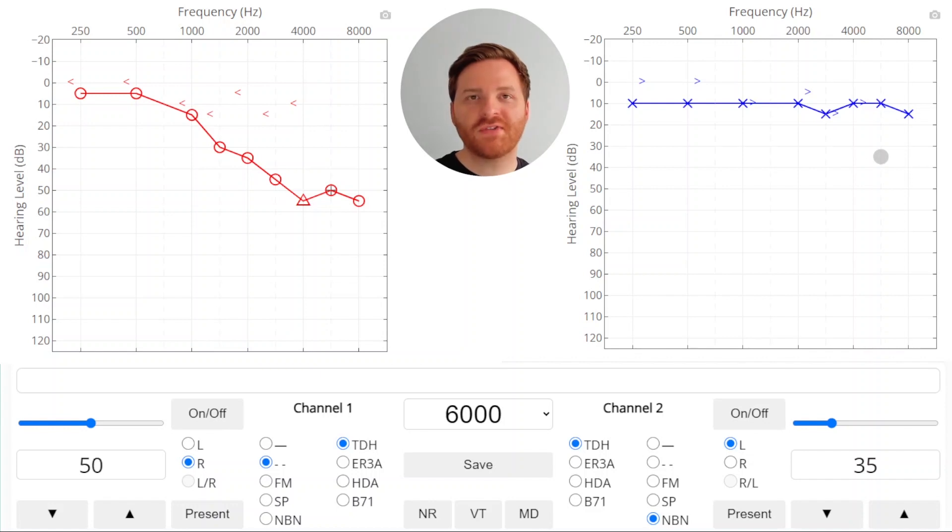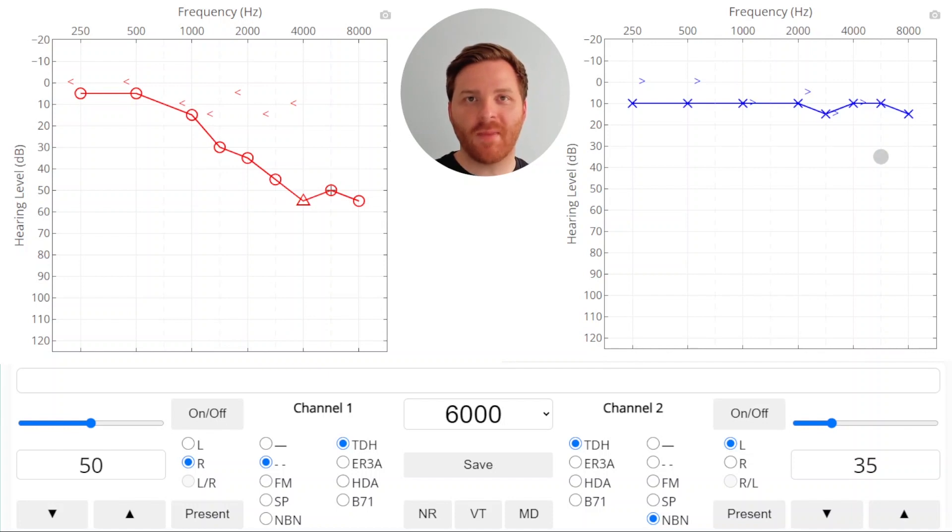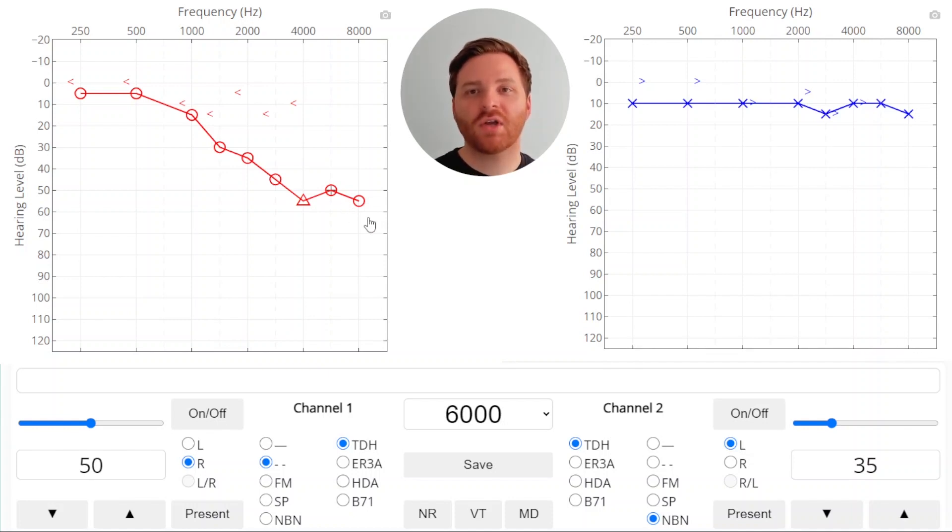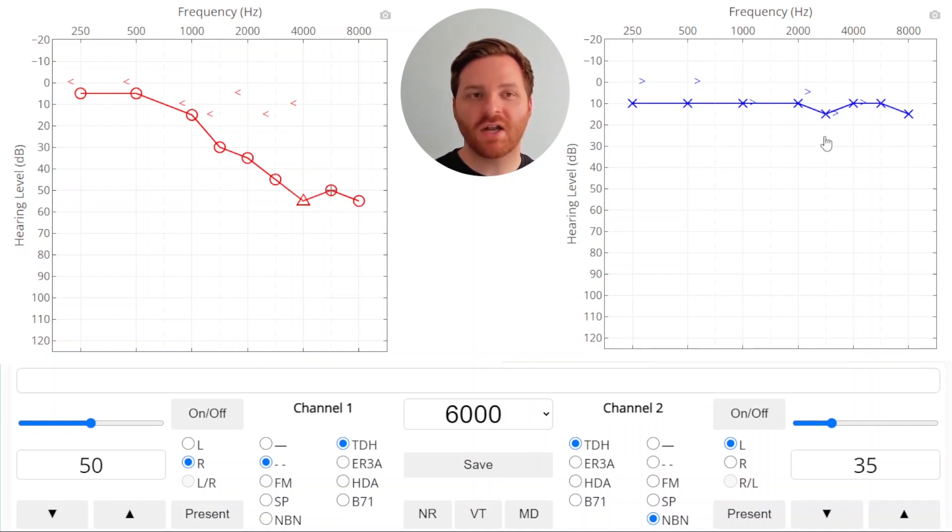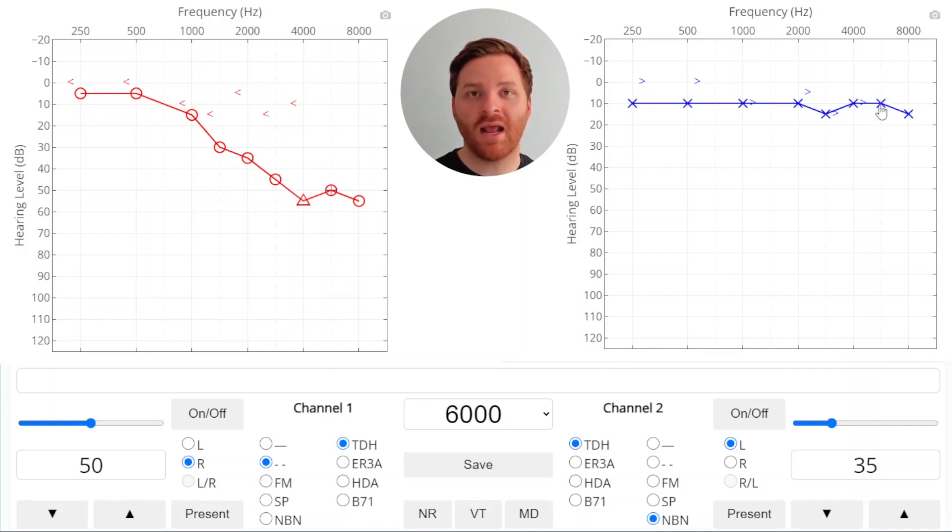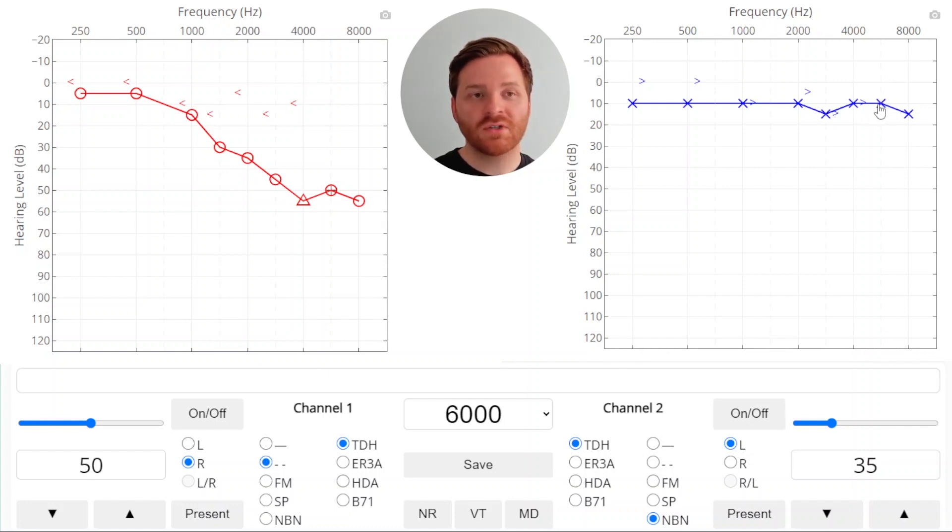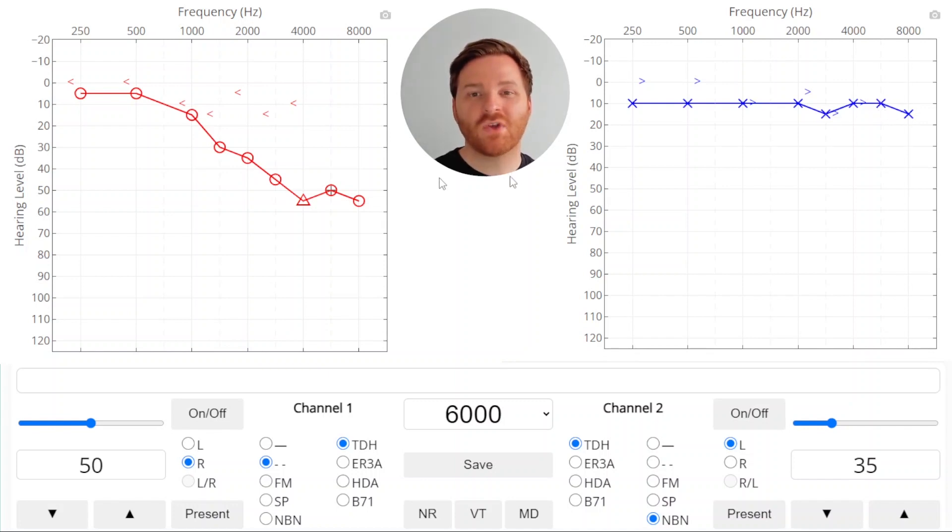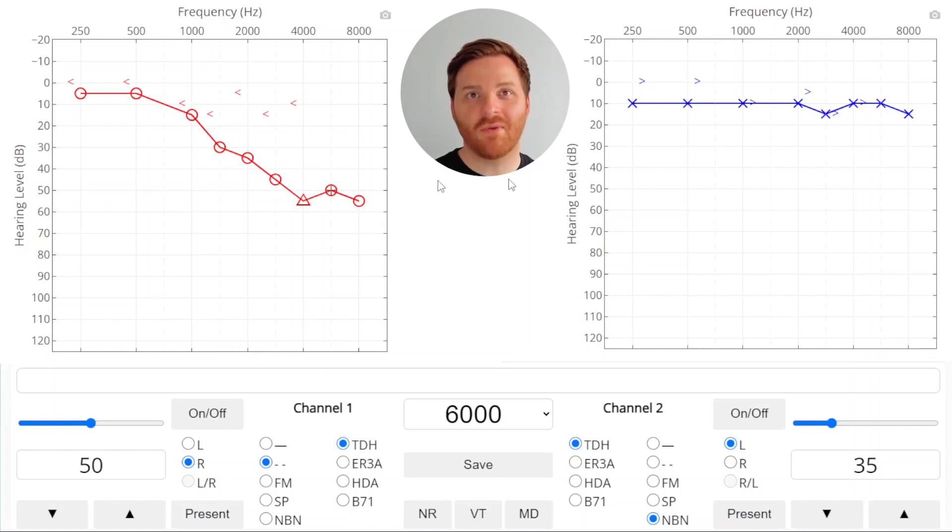When you do the same comparison at 6,000 and 8,000 we don't have the bone conduction thresholds to compare to. So we're going to make a comparison from air to air. Looking at 6,000 hertz, a 50 dB sound would lose 40 dB as it crosses over to the non-test ear and be present at 10. We have a threshold at 10 and we're assuming that their bone and air hearing is similar in the non-test ear. So it's possible that that 10 dB crossed over sound could have been heard by the left ear. And so our response in the right ear might not be actually coming from the right ear. It might be coming from the crossed over sound to the left ear.